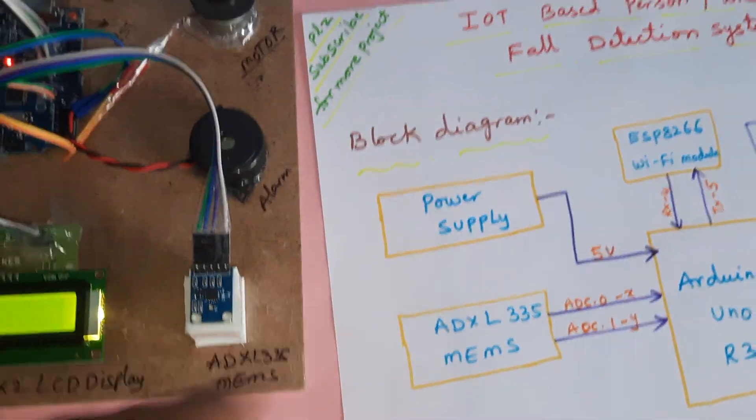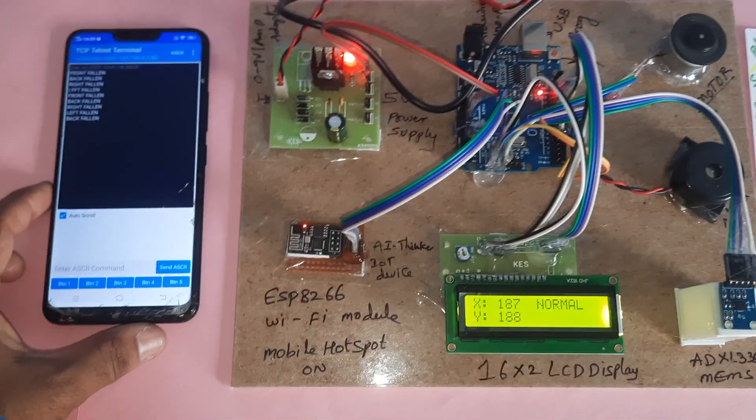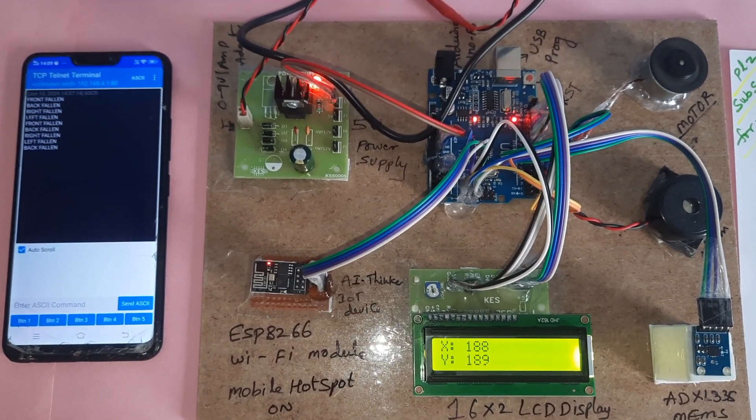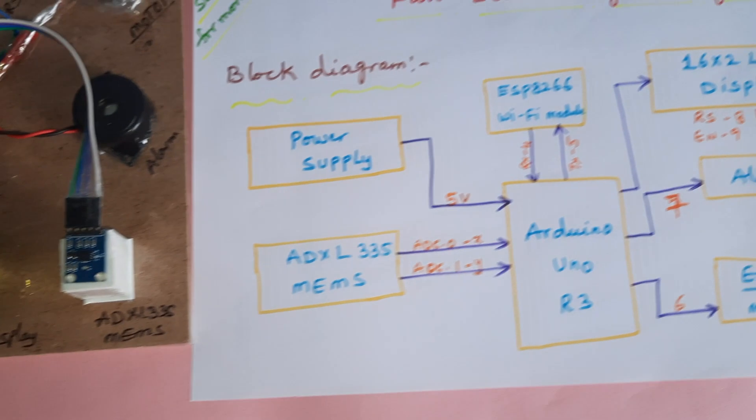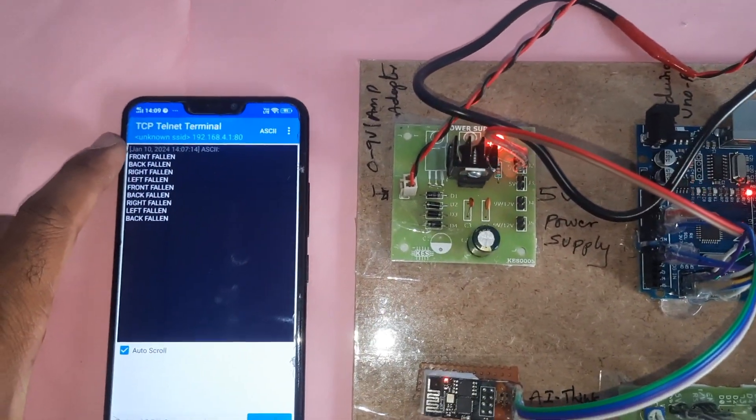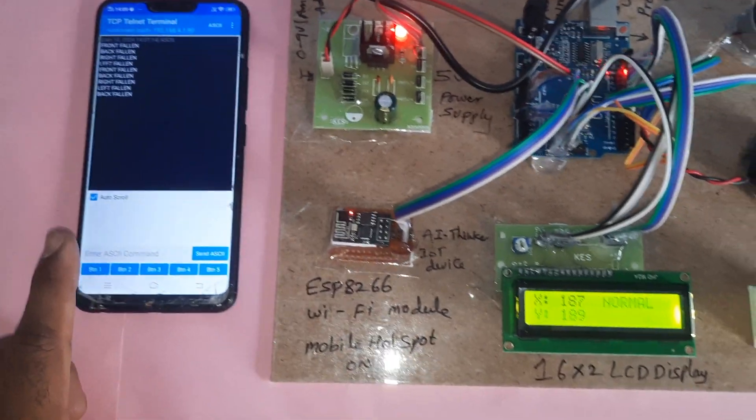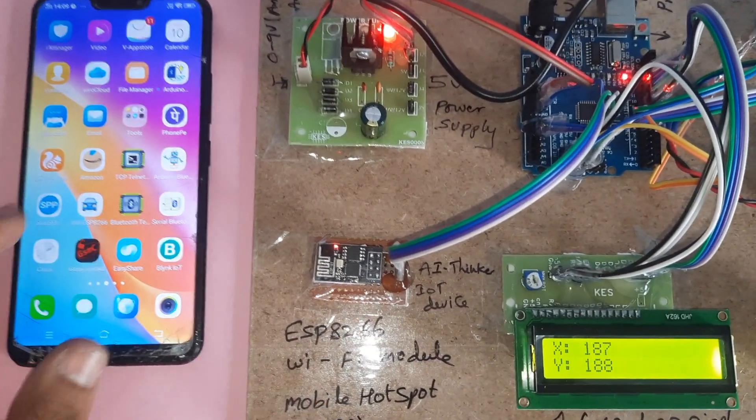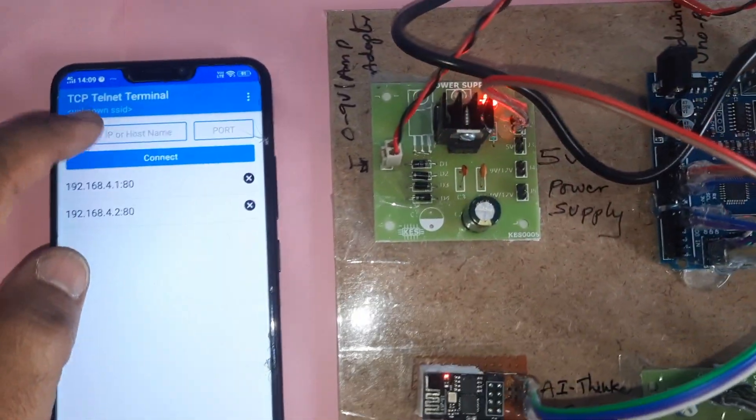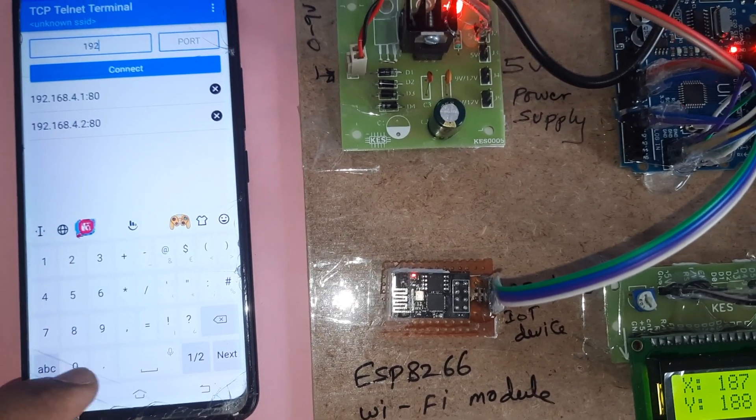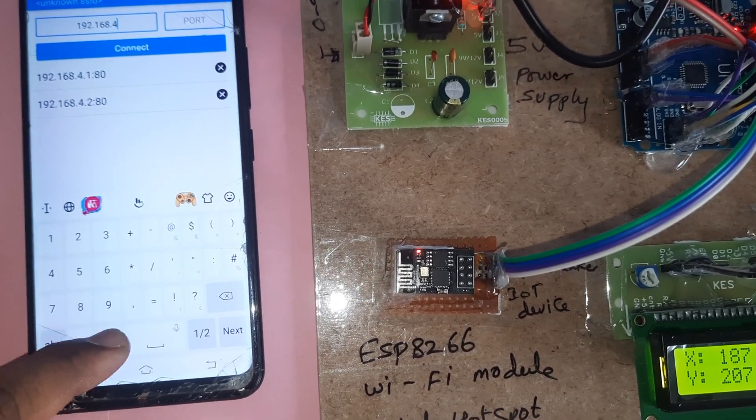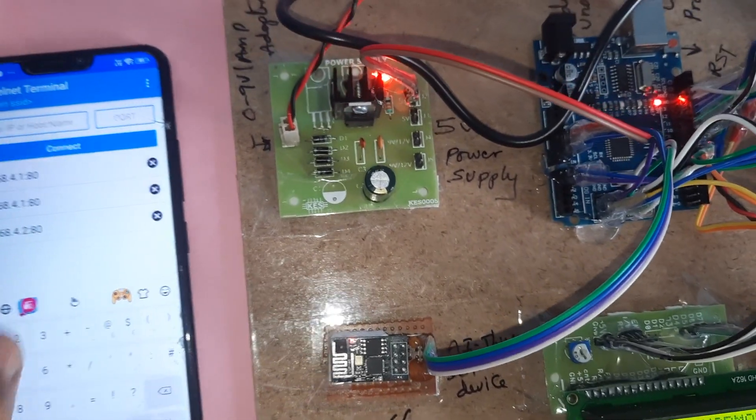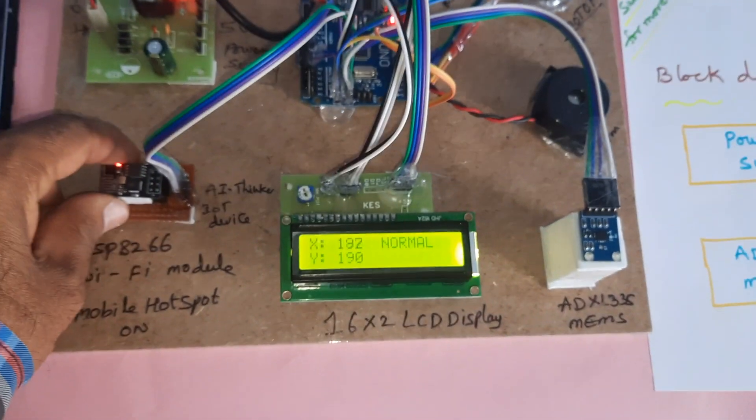So this is our block diagram. The app is freely available on Google Play Store, TCP telnet terminal app. It will open and you can type, or go for 192.168.4.1 column 80, connect, and it will connect.